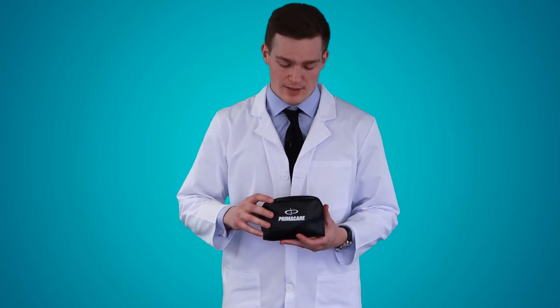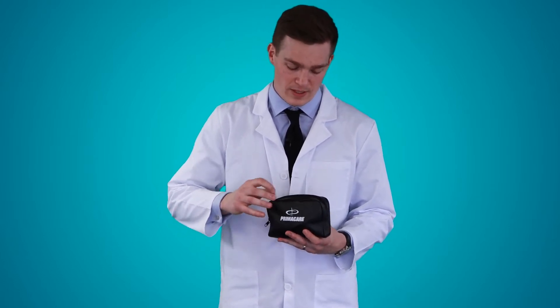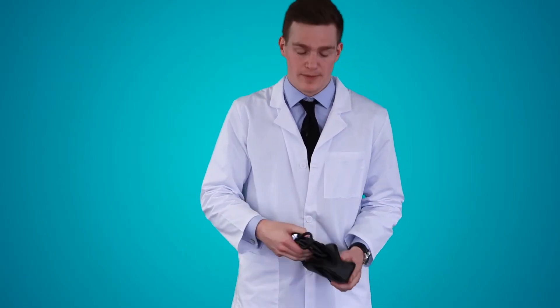This is the PrimaCare aneroid sphygmomanometer. It comes in adult and large size. It comes with a nylon waterproof case. The kit includes a calibration key and the aneroid sphygmomanometer.